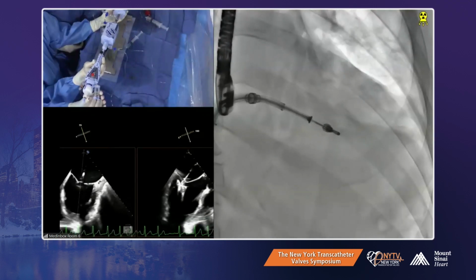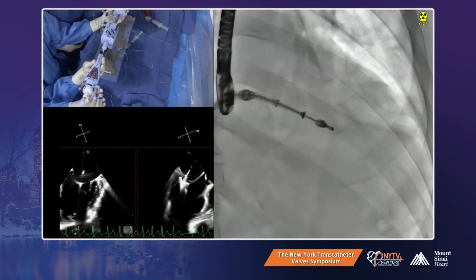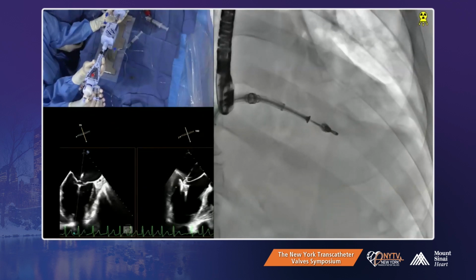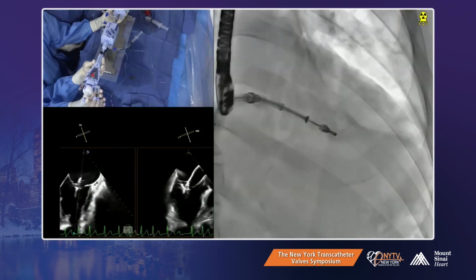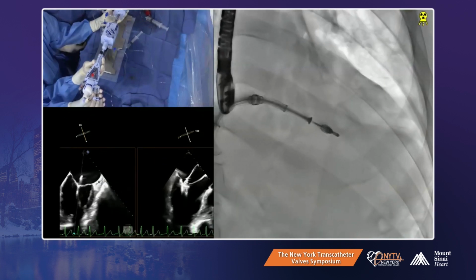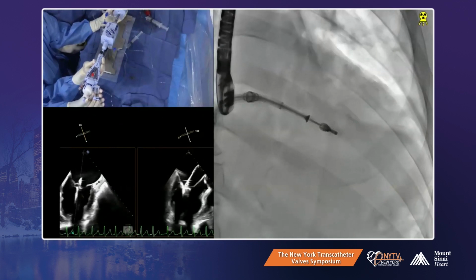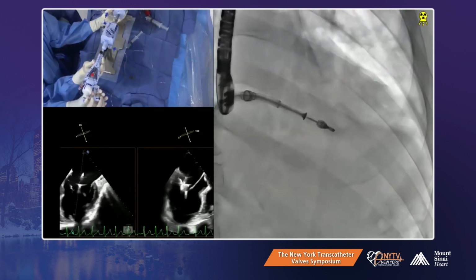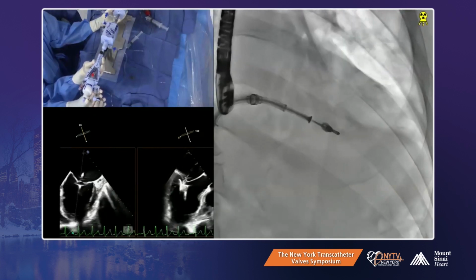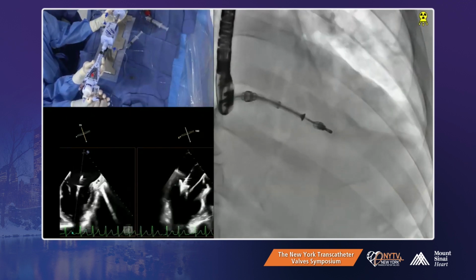The problem is that when the heart rate is high, in diastole, your arms are, even this is not even on, the leaflet is going to get kicked off, right? So I think we should try to do anterior again and then go posterior. I just don't see with this heart rate how we can do both at the same time, even though they're on, it's not going to be on sufficiently.